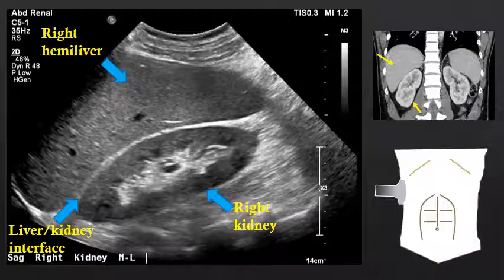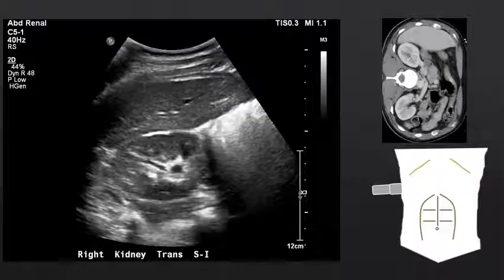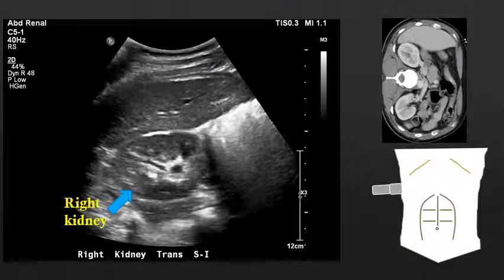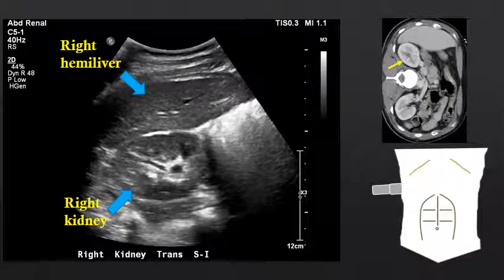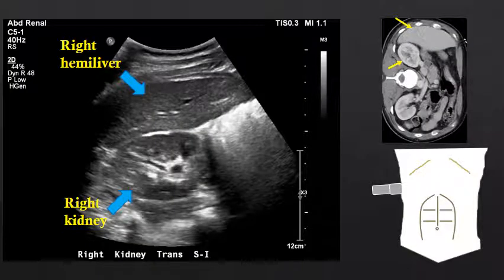In general, the kidney should be slightly hypoechoic, or slightly darker, than the overlying liver. If we move into a transverse view, we can see the liver-kidney interface with the kidney in a transverse orientation. We can see that the kidney is similar in echogenicity or slightly hypoechoic to the overlying right hemiliver.